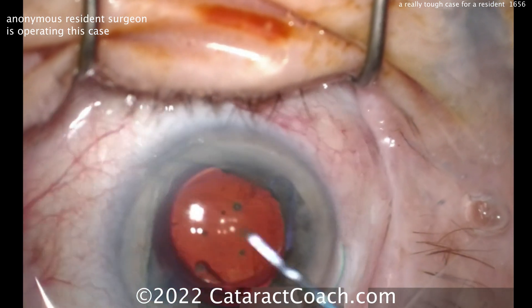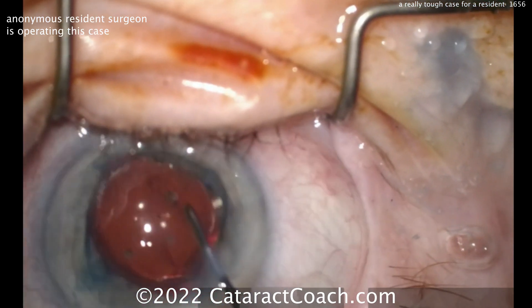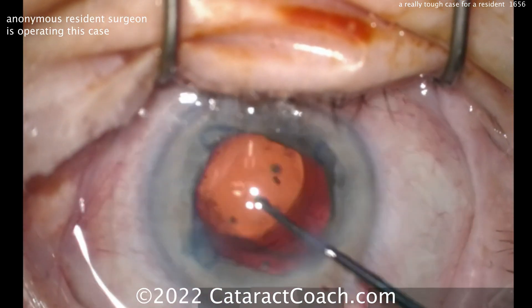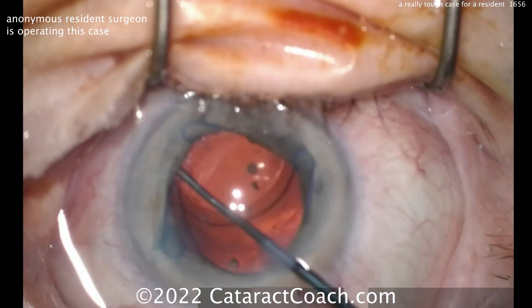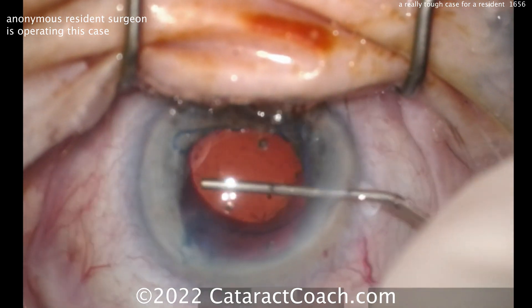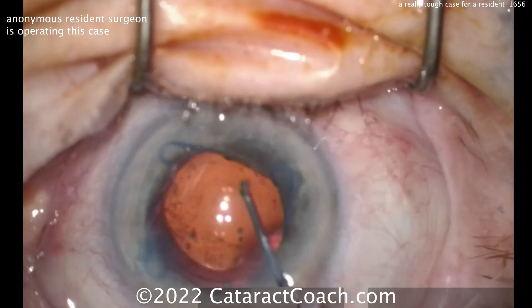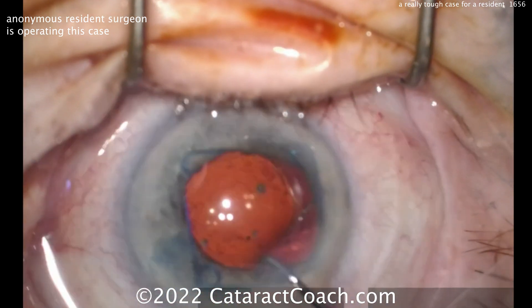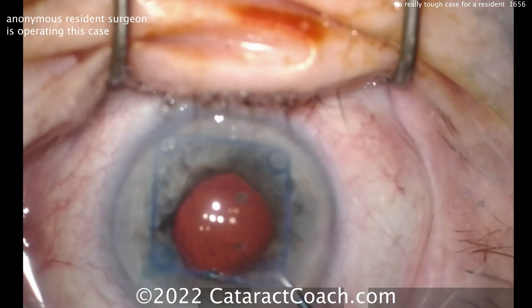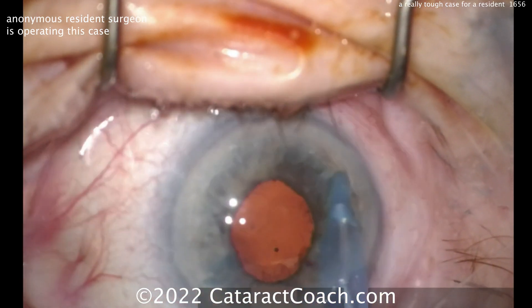You've got to be able to use both hands — there's no excuse for that. My homework assignment for you, young doctor: you are not allowed to eat any food, brush your teeth, or do anything else with your right hand for one year — everything only left hand. It seems like you just keep wanting to use the right hand and don't embrace two-handed surgery. End of the case — taking out that Malyugin ring, bringing it out nice and slowly. You may have an easier time using the injector to suck it back in. Take out the viscoelastic, close it up. I bet this patient was thrilled — you did a great job. Keep up the good work, and use that left hand!